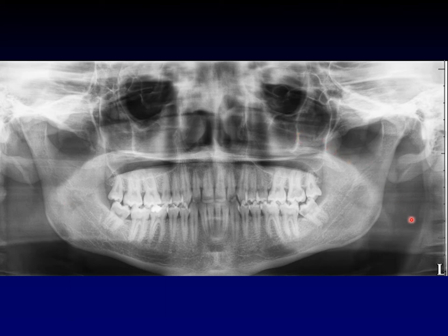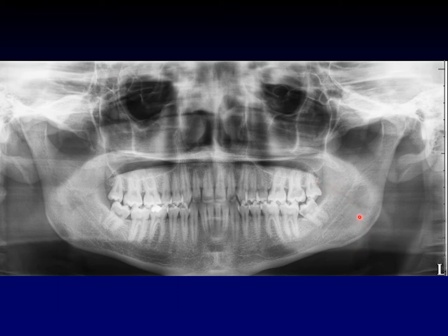You can see the epiglottis sticking up and the base of the tongue coming down. That line of the base of tongue is very easy to mistake for a fracture line of the jaw, but it's not. That's just the base of the tongue.